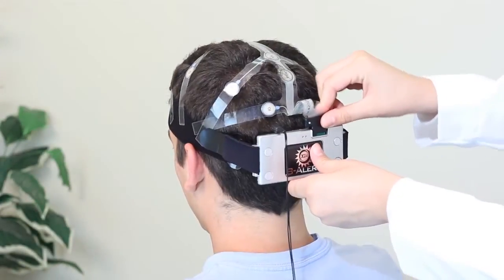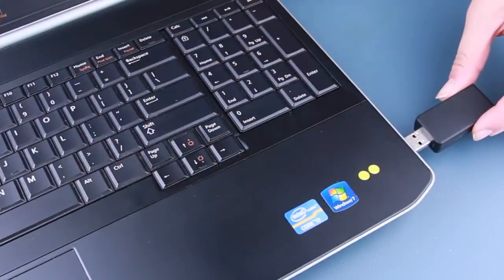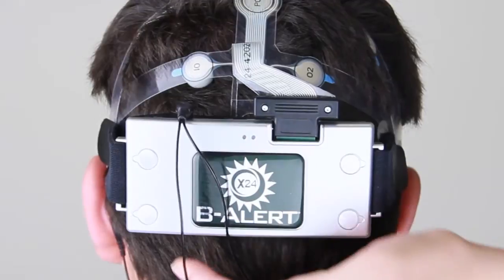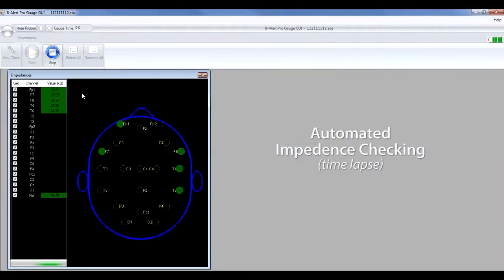Once the strip has been plugged in and the linked mastoids are set, X-Series headsets are ready to power on for acquiring medical-grade neurophysiological signals. Impedance checking verifies good quality signals at each and every site.